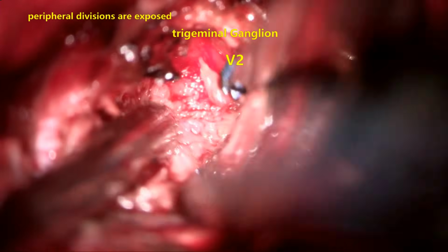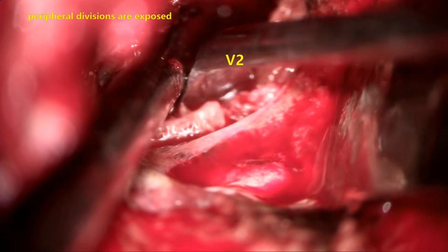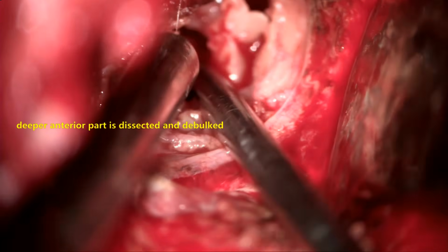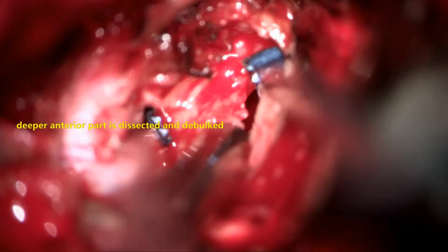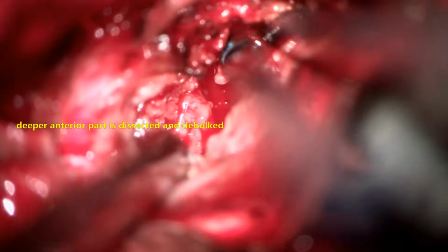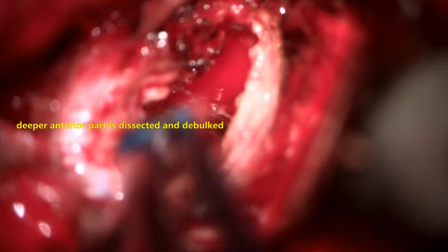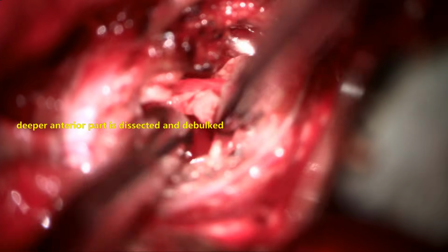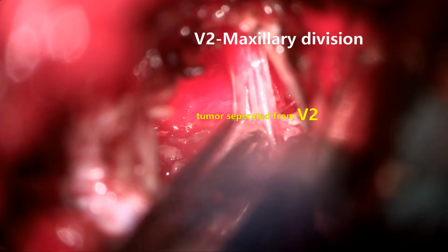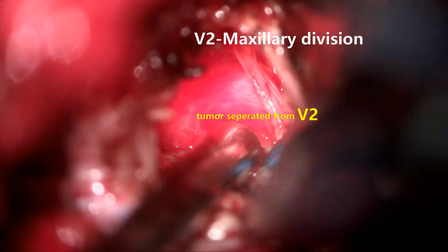You can see the division there, and at this juncture the microsurgical dissection should be under high illumination and magnification, and smooth gentle dissection, peeling the tumor from the origin of the nerves, and try to preserve the roots or the divisions as much as possible. Especially our aim should be, under any circumstances, that the first division, the ophthalmic division, should be preserved. That's V2 now. You can see the tumor is originating from there.